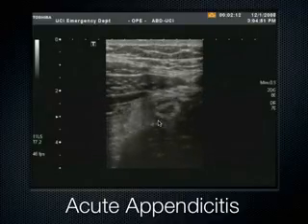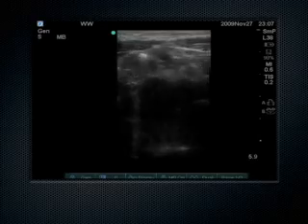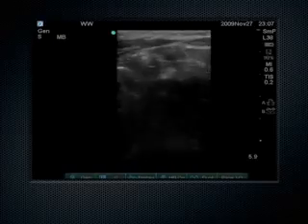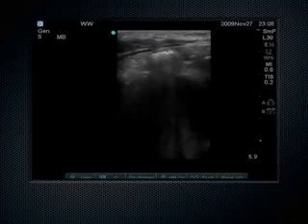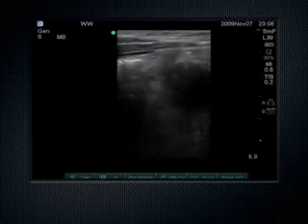And the patient lets you know too that you found their appendicitis in a very clear way as you're doing this. Sonographic Murphy sign, sometimes people call it. Not sonographic, but sonographic Murphy sign is for the gallstones. Sonographic McBurney's sign is what some people call this, because McBurney's point is the location where the appendix usually lies in the right lower quadrant, which I know you guys have been studying.